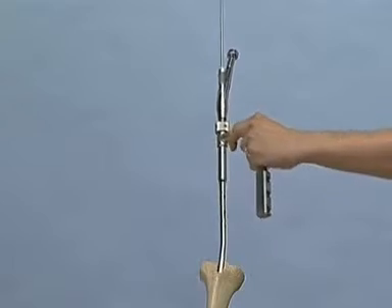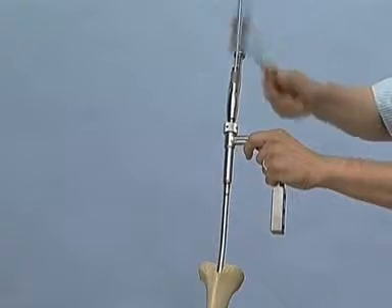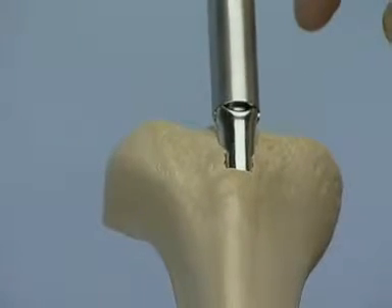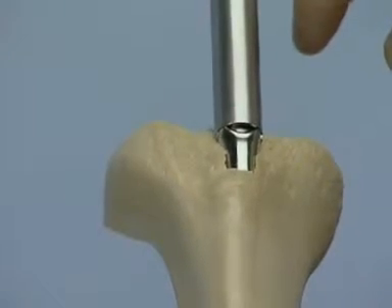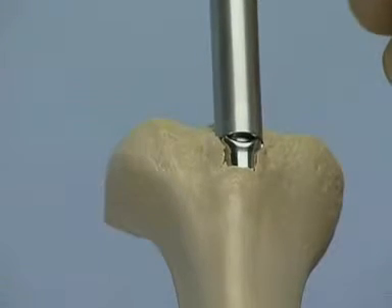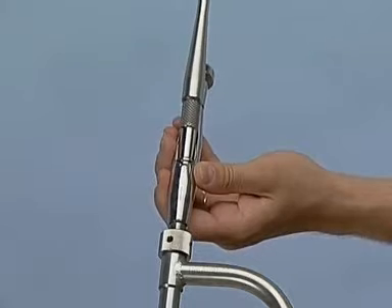The nail is now introduced with careful blows of the hammer. It is important that the nail advances farther into the tibia with every blow. The nail is inserted until it is flush with the insertion site. In the clinic, passage through the fracture zone and the final position of the nail have to be verified in two planes on the image intensifier. When the nail has been positioned correctly, the curved driving piece can be taken off and the reaming rod removed.